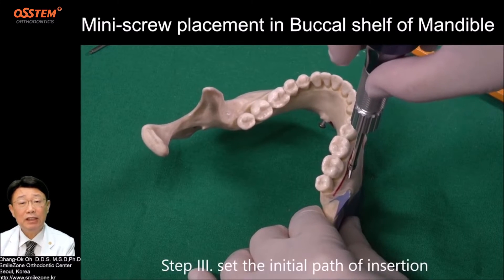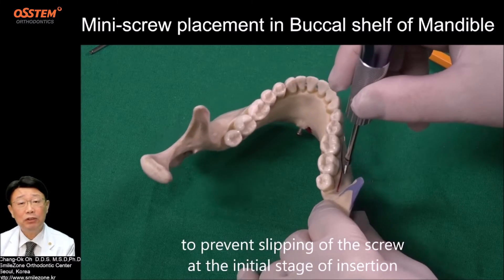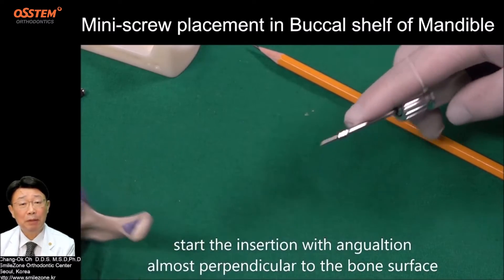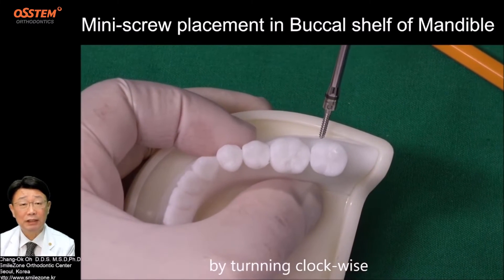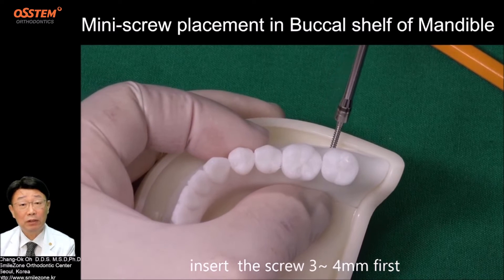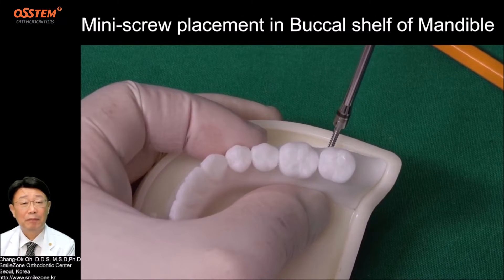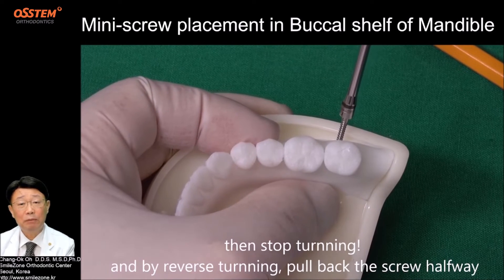Step 3: Set the initial path of insertion. To prevent slipping of the screw at the initial stage of insertion, start the insertion with angulation almost perpendicular to the bone surface. By turning clockwise, insert the screw 3–4 mm first. Then stop turning and, by reverse turning, pull back the screw halfway.